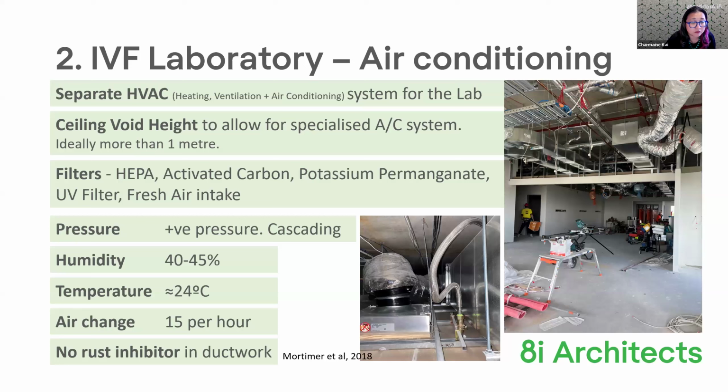So the amount of fresh air intake into a lab is generally a lot higher than your normal air conditioning. So with that fresh air intake, there are things to consider, particularly the filter that goes into the air conditioning system from the fresh air intake. So that one's really important for things like when there are, for example, bushfires at the moment, that all those particulates that are in the air from the bushfire is actually removed before the air goes into the lab.